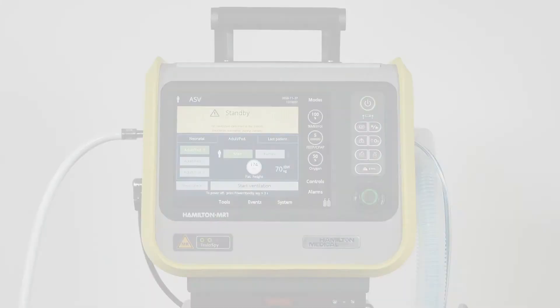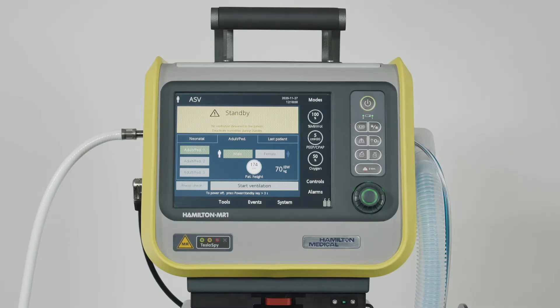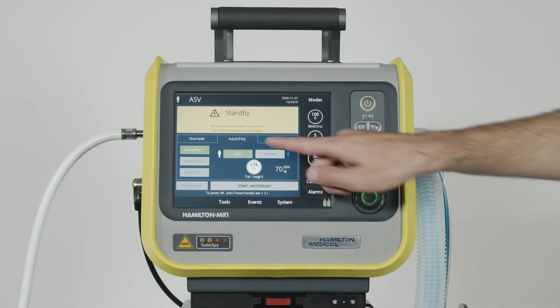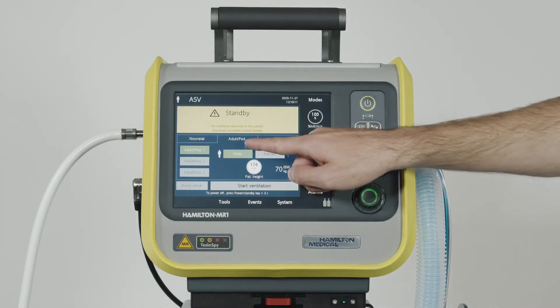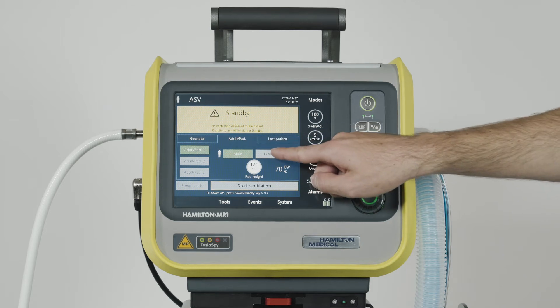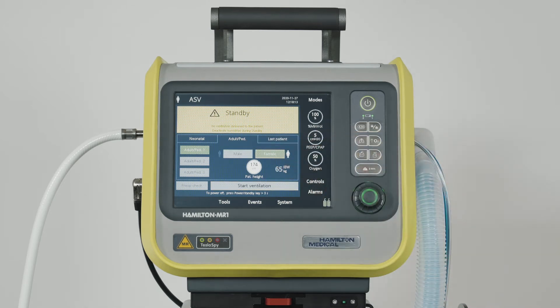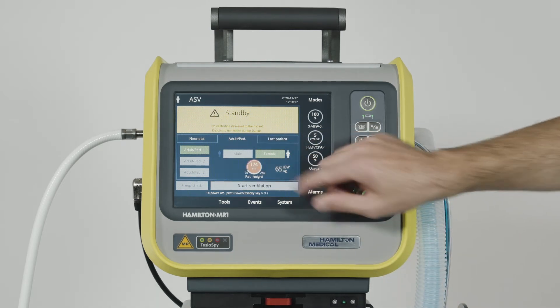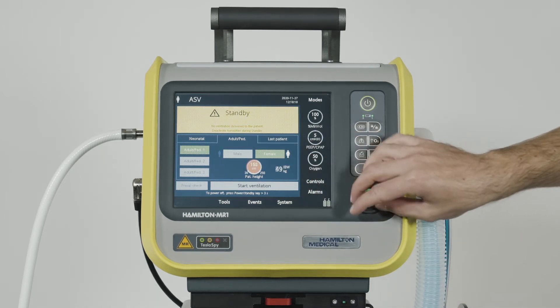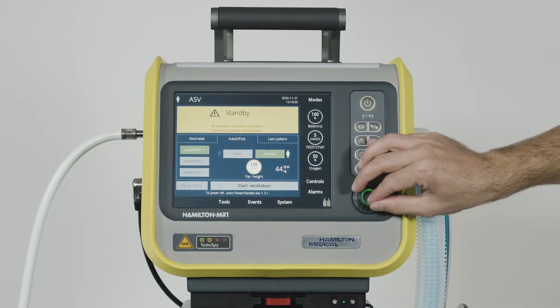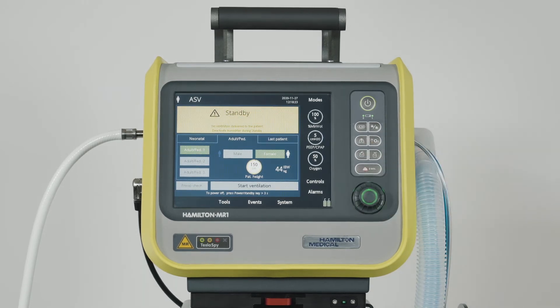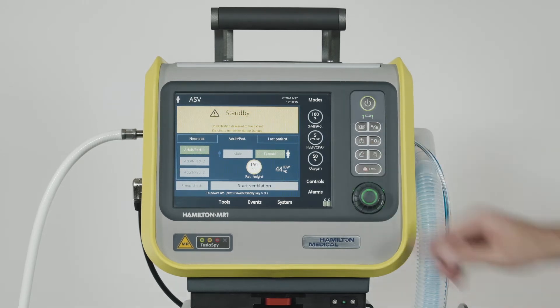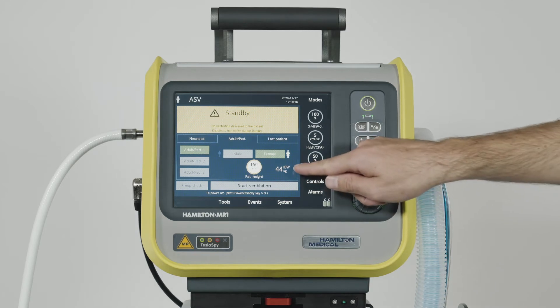First, you need to select the right patient group and sex. Then you can specify the patient's height. Based on this information, the ventilator calculates the patient's ideal body weight.